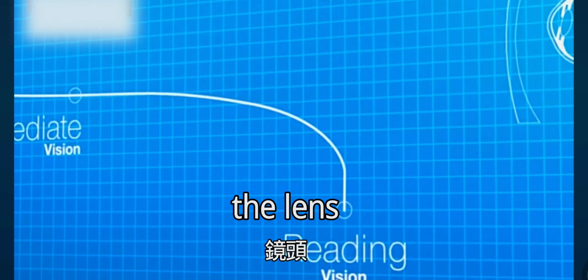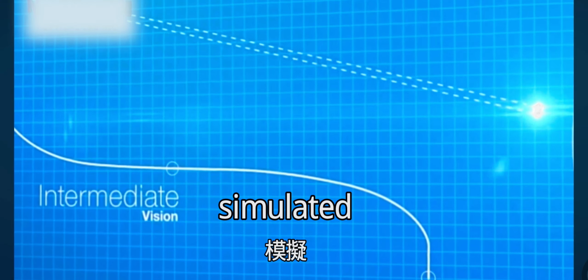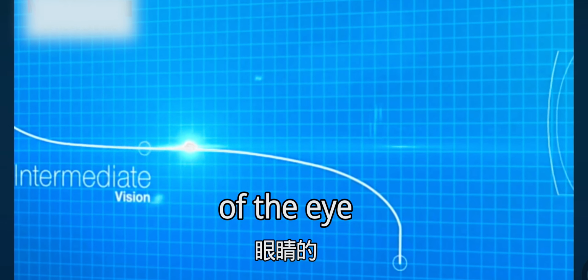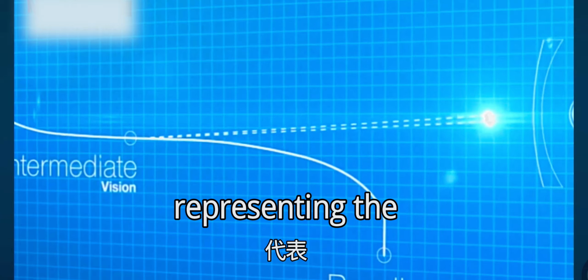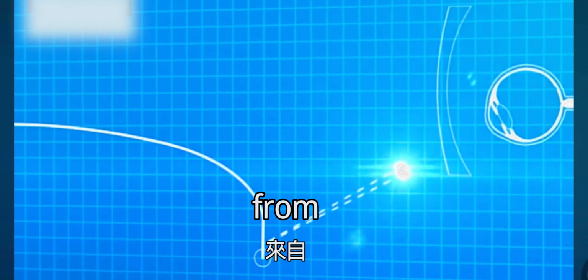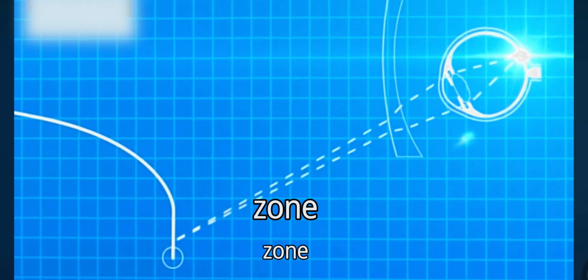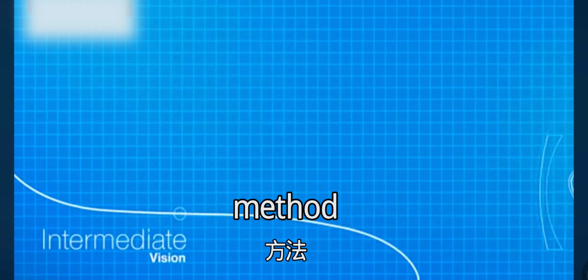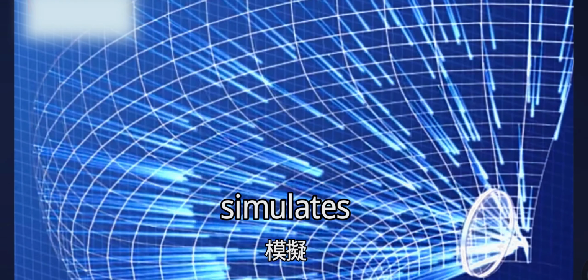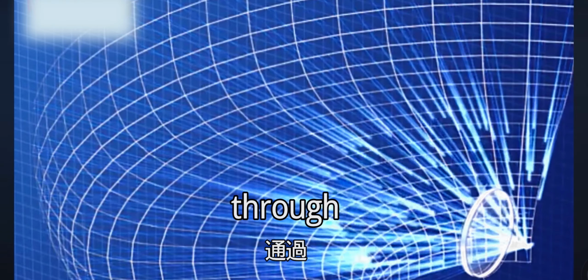In the upper part of the lens, designed for far vision, the passage of rays coming from distant objects is simulated. In addition, the calculation takes into account the vertical movement of the eye and simulates the rays representing the intermediate vision. Finally, there is a simulation of rays from objects closest to the eye, the reading zone. The ray tracing method is extended to include the space object. This mathematical model simulates thousands of rays coming from different zones through the front and back surface of the lens, which is optimized during the beam refraction.